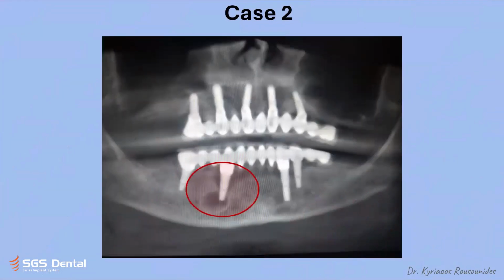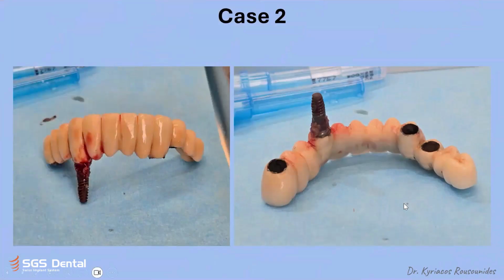This is one case that I showed in Georgia. This is to show case 2 and case 3, how multi-units help me keep the whole prosthetics for my patient. We see here one infection. We don't know how it happened. It came from another colleague. I needed to do something. I removed the whole one.